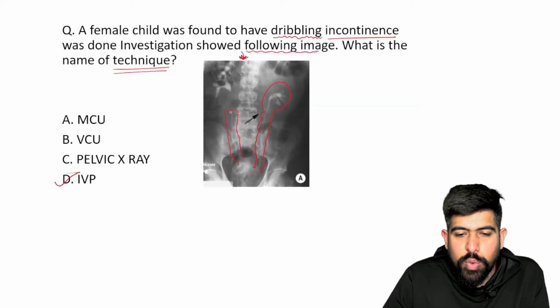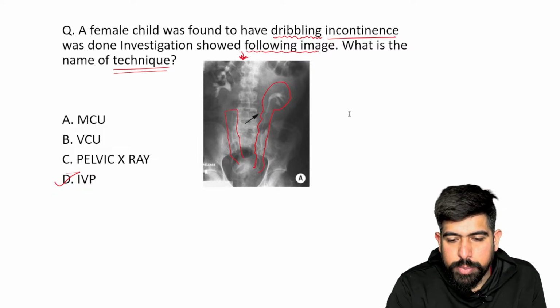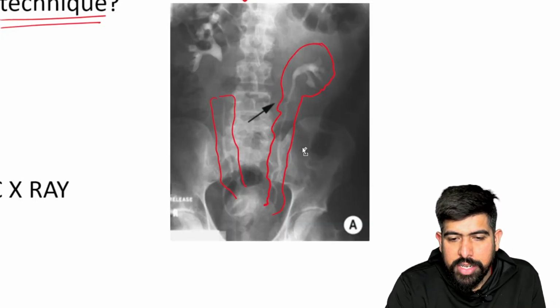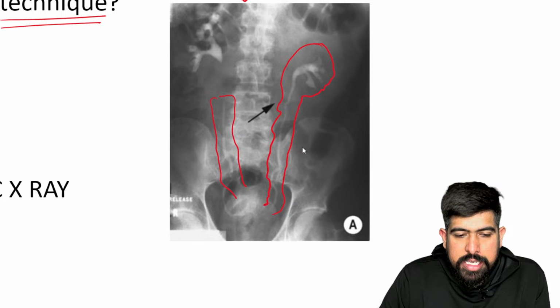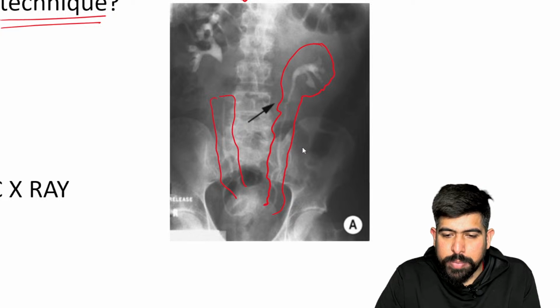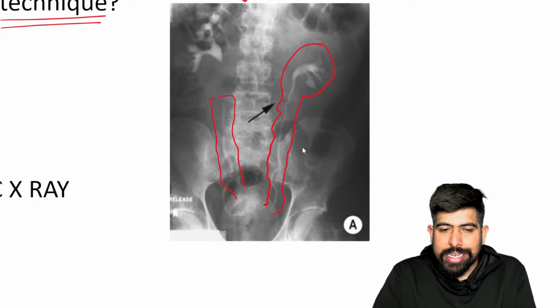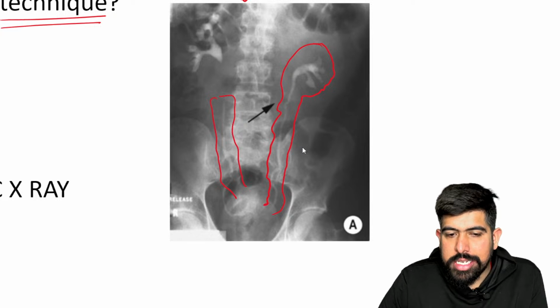But I'm again asking you, what is the diagnosis? Again the doctor is saying sir, duplex of the ureter is seen, but I don't think so. I'm zooming in a little bit on the image, so I think this is clearly visible to you. Can you see here, doctor? Is it the drooping lily, as you mentioned, or the staghorn calculi? Now that I zoomed in, it's perfectly visible. For making the diagnosis, can you see that this is not a duplex? There are no two ureters here.